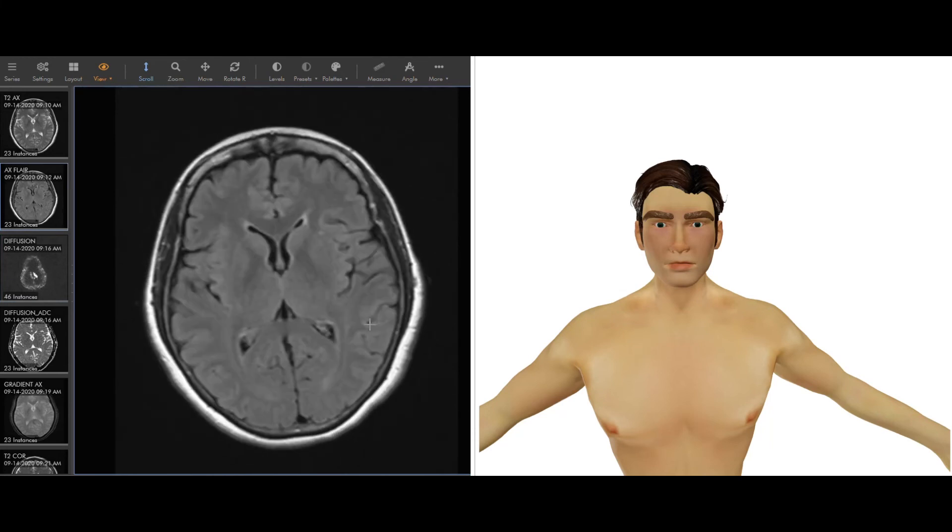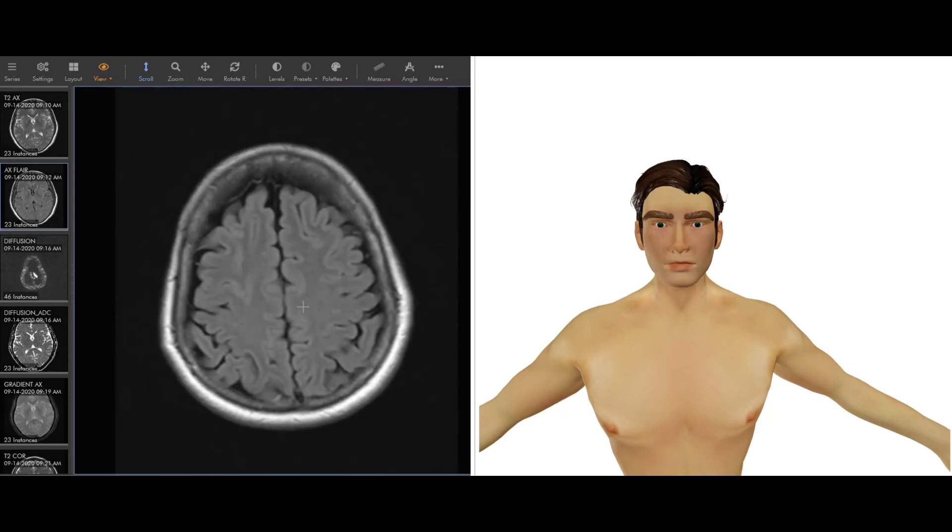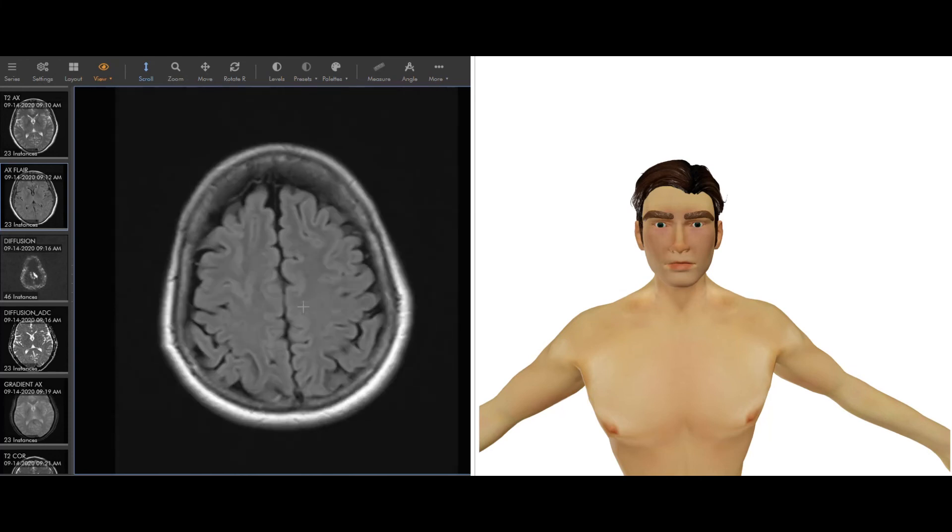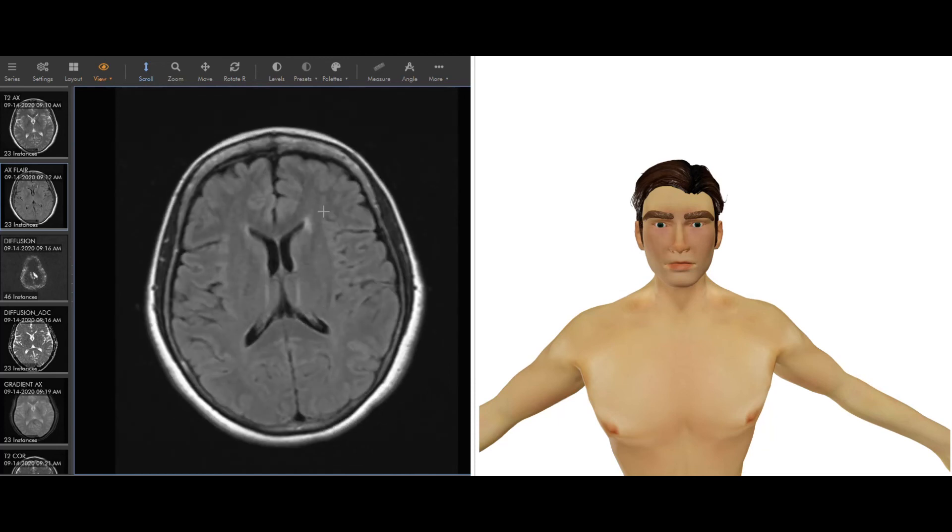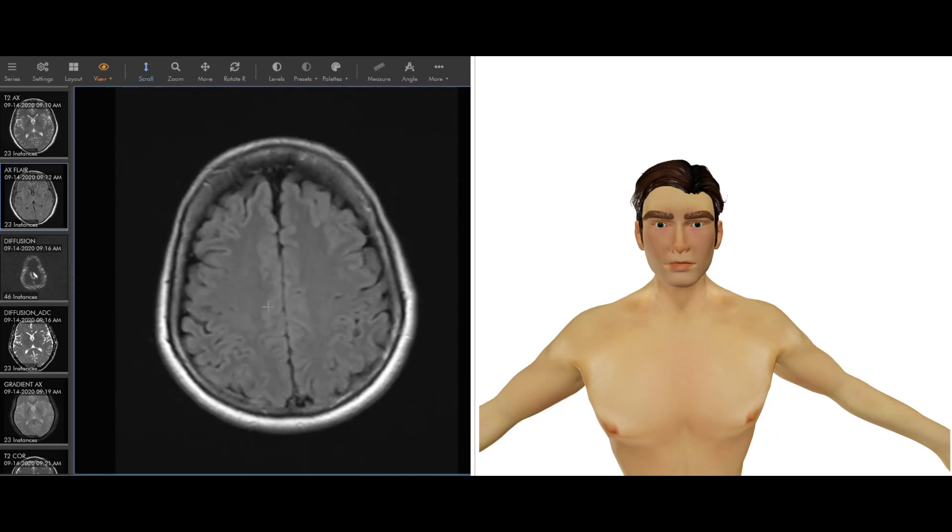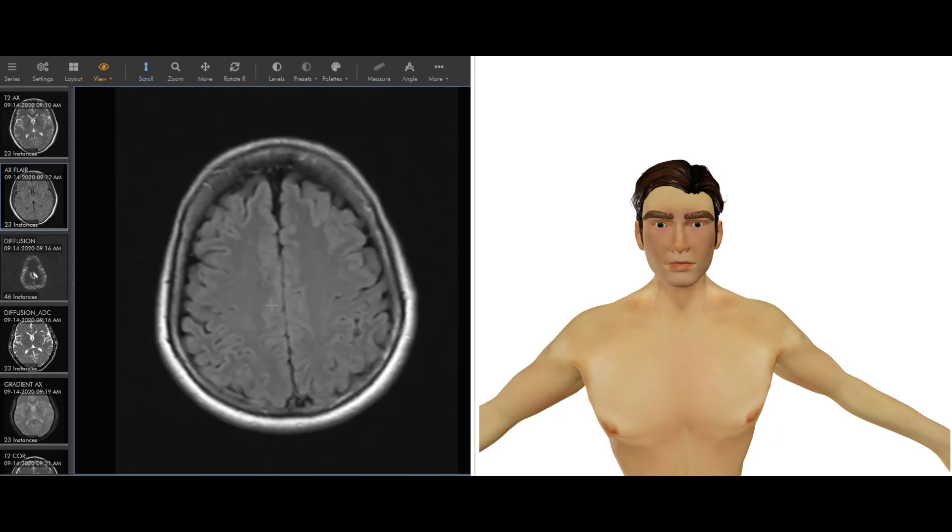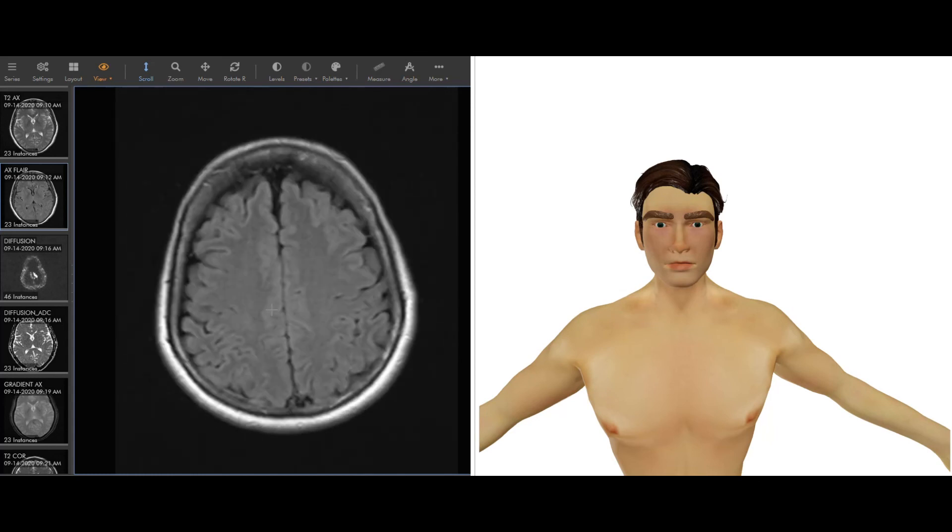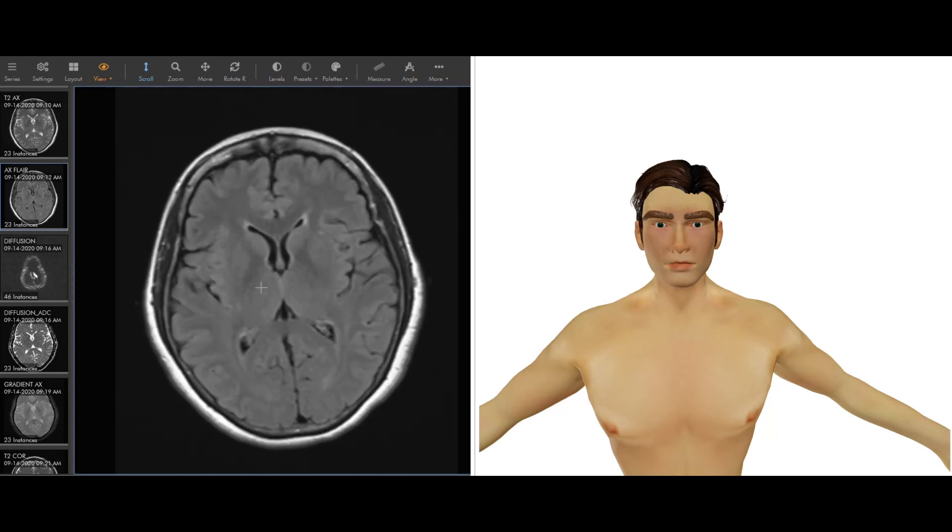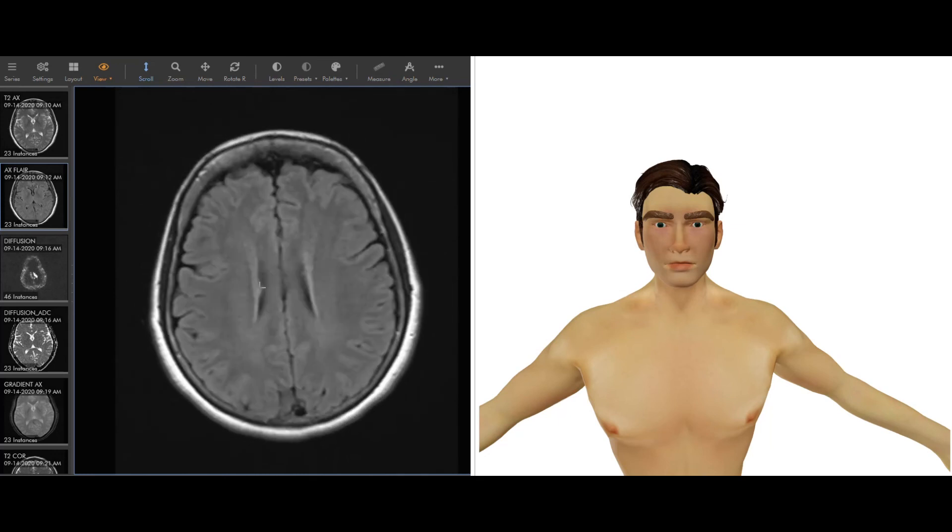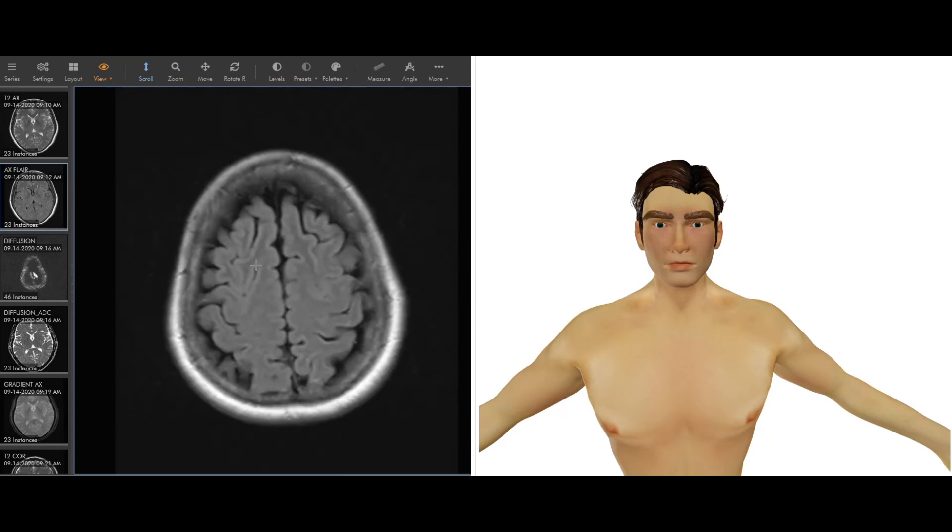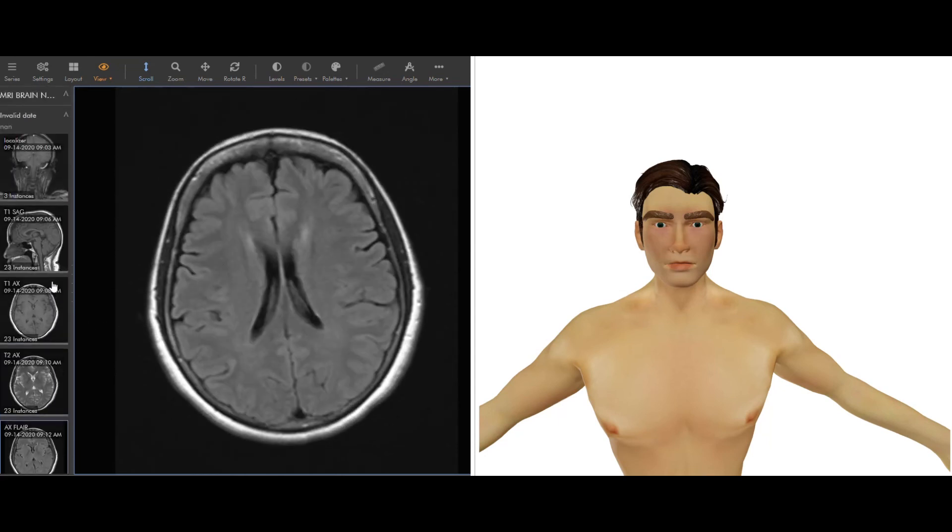Lastly, a common brain sequence is what's called a FLAIR image. Instead of making fat black like a STIR image, this is making fluid black. So you can see here the fluid is perfectly black. The reason this is done is it actually brings out things in the brain itself, so tumors or what we call edema, which is brain swelling, or demyelinating lesions such as MS, they will be very bright on this and easy for us to see.